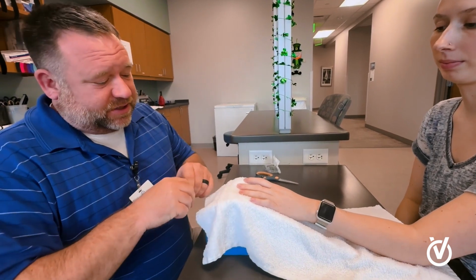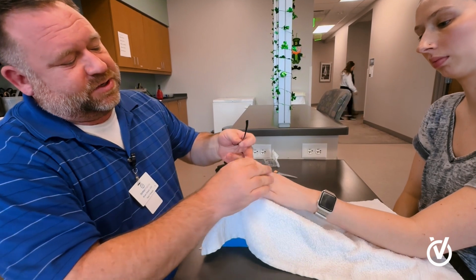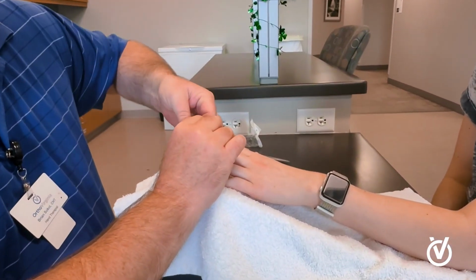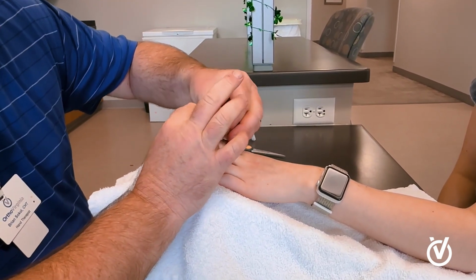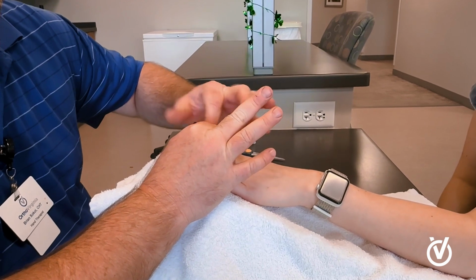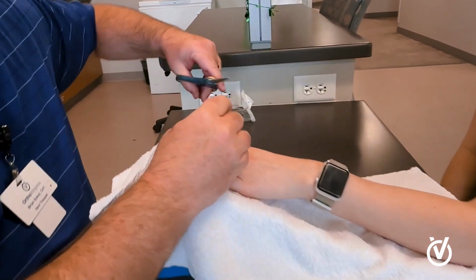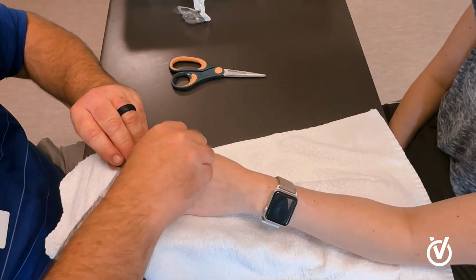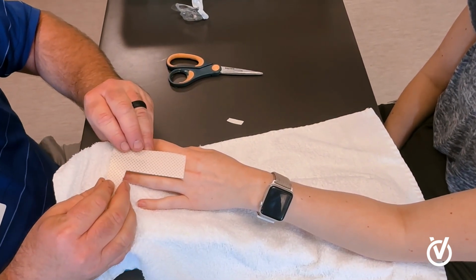First thing I do is I take a piece of kinesio tape and I take the DIP joint into extension. This will free up my hands to not have to worry about that as much. So I tape the DIP straight, heat up the adhesive a little bit, and then I cut this so it doesn't cross the PIP joint. I cut a J-type splint.